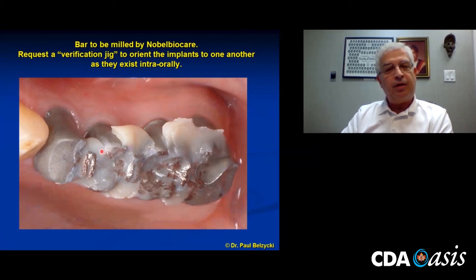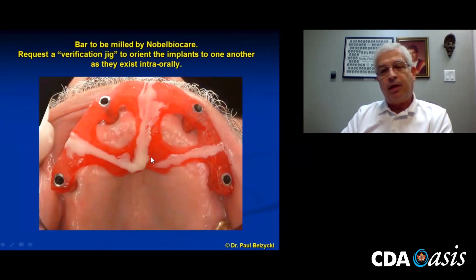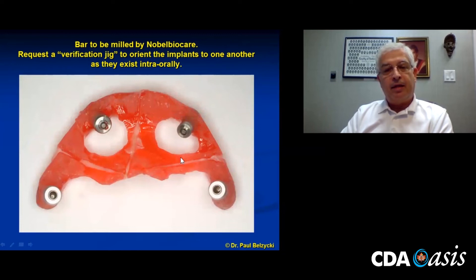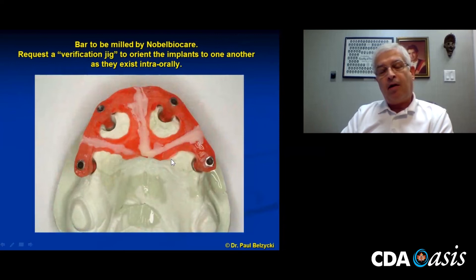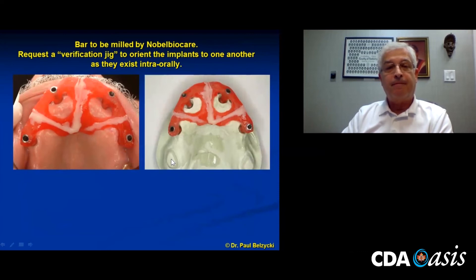Just flowing some methyl methacrylate — I could have used red pattern resin, but I've got tons of this stuff so I just use that all day long. Now they're all attached, so each implant can be related to each other as it sits in the mouth. It did go back on the original stone model that was made, the original master model. Once I had this, I thought — this is neat, because I can pick up a whole lot of other parameters with this as well.